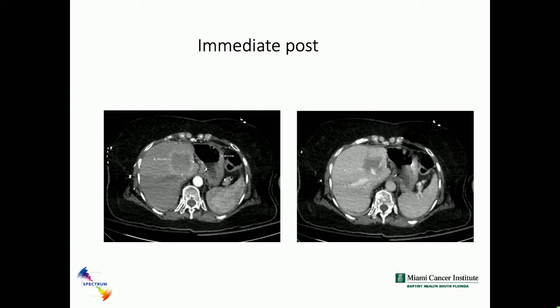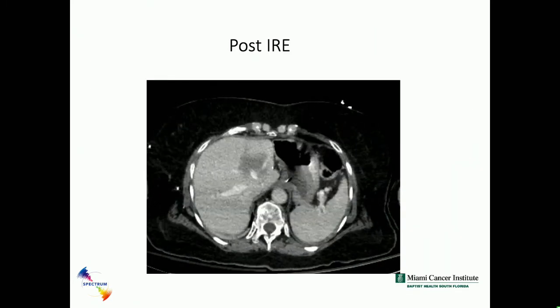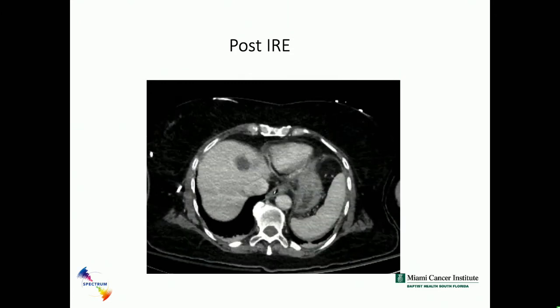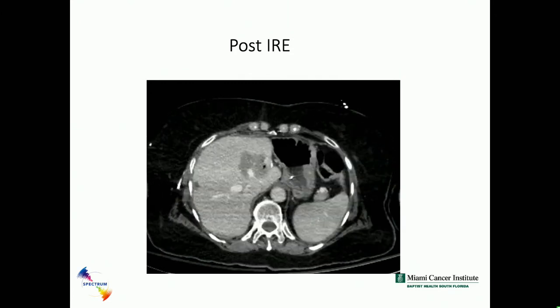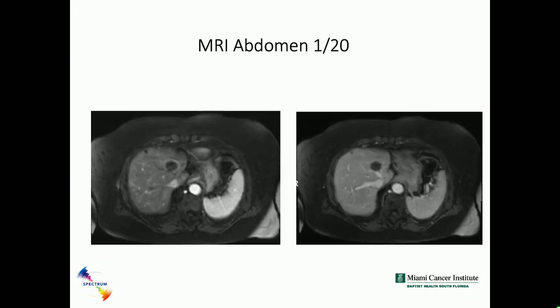And we're going to look at some of the follow-ups of the same patient. So this was the immediate scan. Next slide, please. And this is a video of the post-IRE where you can see the vessels being preserved and the ablation zone. Next slide, please. And so this is about a month after the treatment.